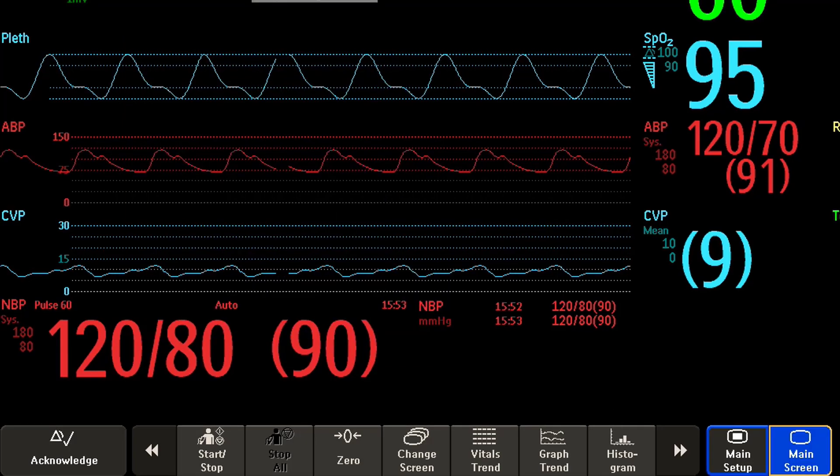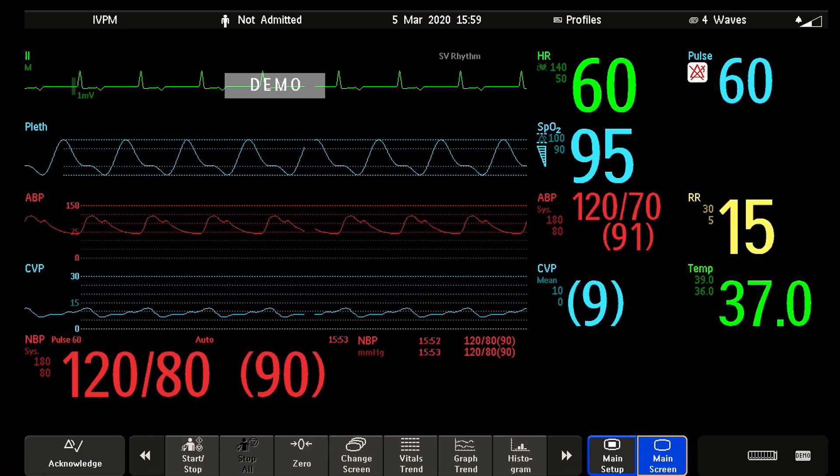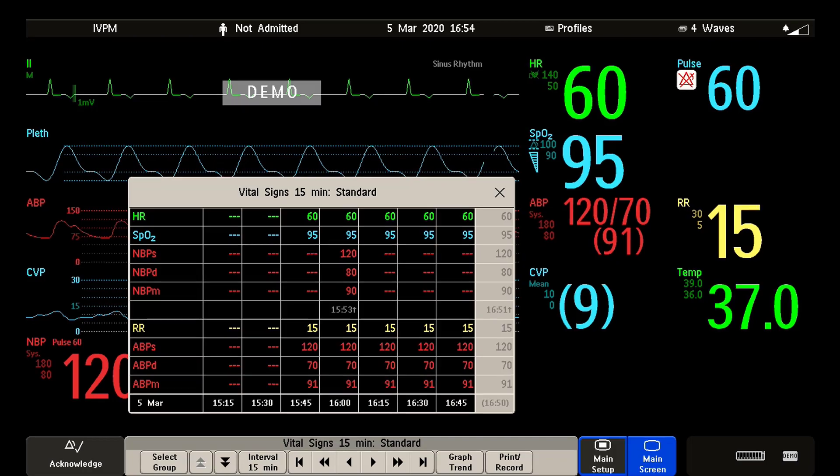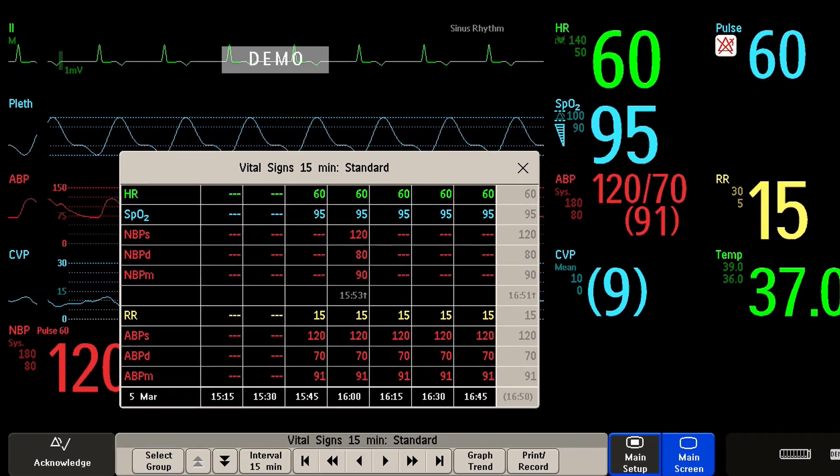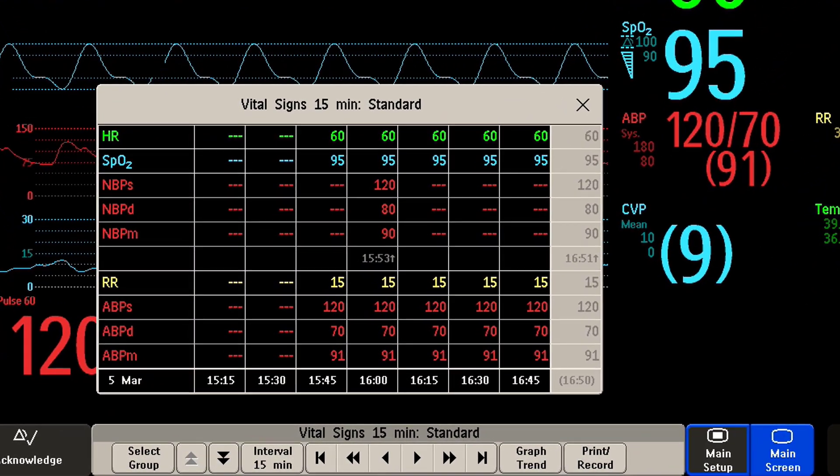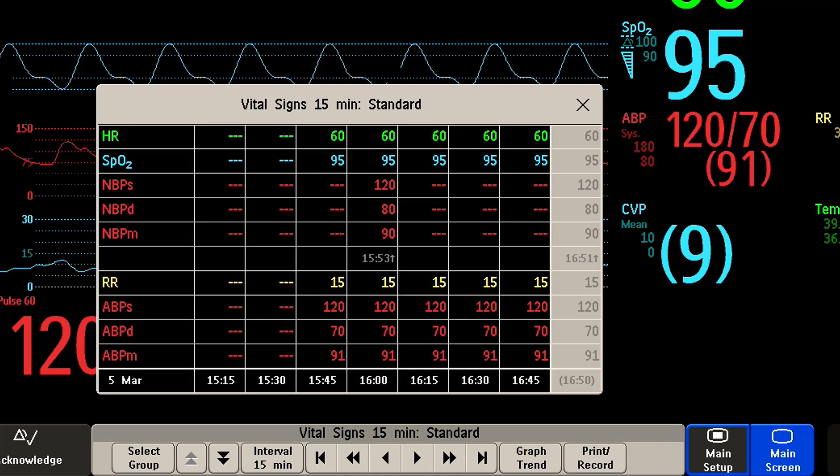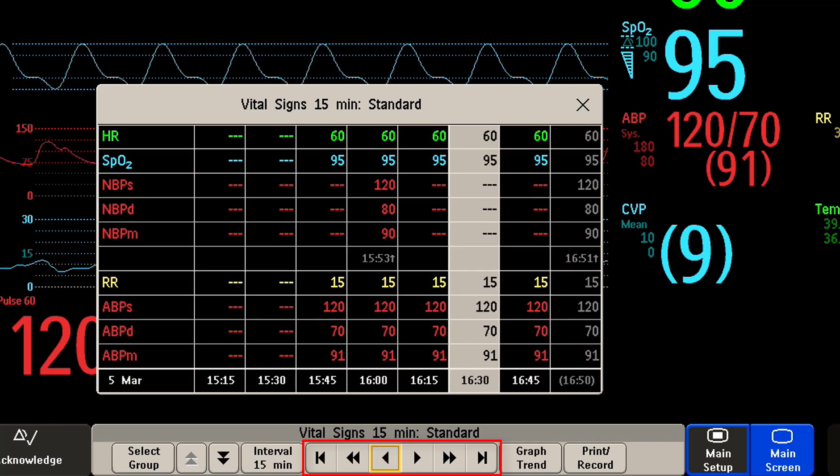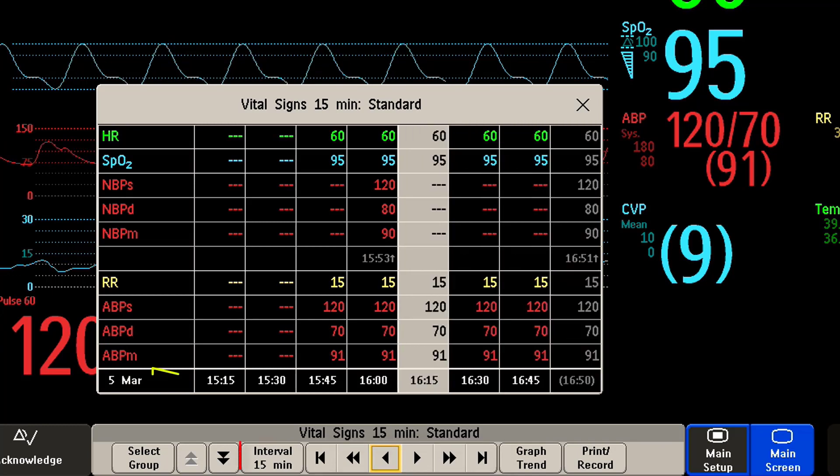When you open a trend window, a selection of pop-up keys appears to let you navigate through the stored trend data and carry out trend related tasks. I can move the cursor to navigate through the trends timeline and change the interval time of the trend.